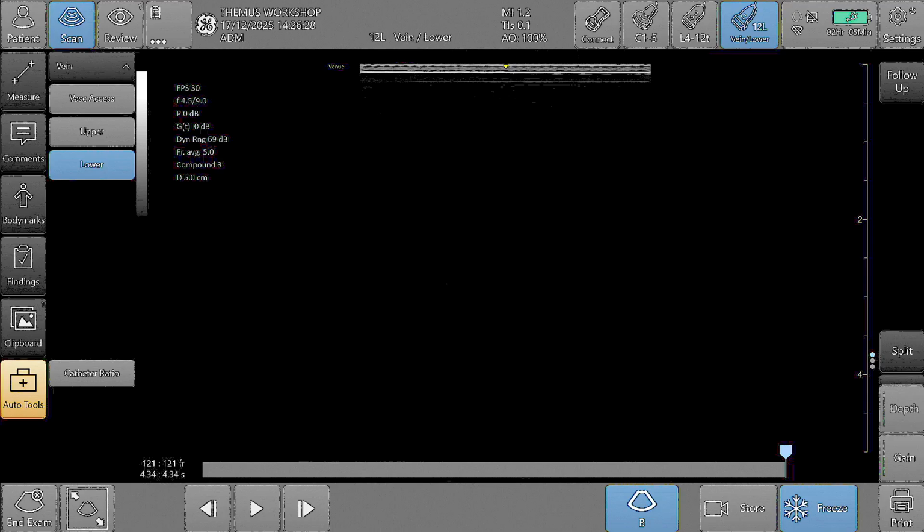It's a non-invasive evaluation of the end organ to find the proximal part, because right now we don't have an accurate non-invasive way to evaluate right atrium pressure. If you have invasive monitoring that already gives the right atrium pressure correctly, then you don't need to measure the end organ, because all we are doing is reflecting right atrium pressure elevation. That means the patient is at risk for venous congestion, right? All these patterns may reflect an RAP of more than 15, right? Any question?